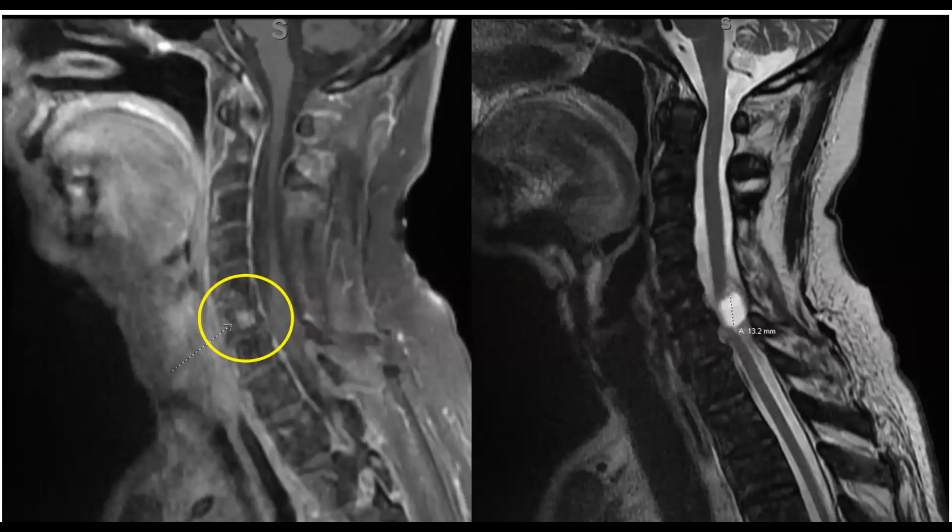There is, right here, at C6, C7, a vertebral body metastasis of the prostate carcinoma. I didn't have all the planes. I can't tell what it's doing. I don't know. But right there, right next door to this metastasis, is the schwannoma. And so it probably is, I mean, it could be, statistically, I'm not sure, but probably a collision tumor.